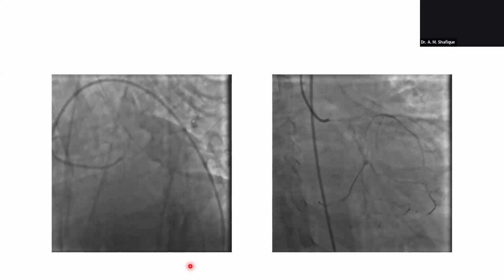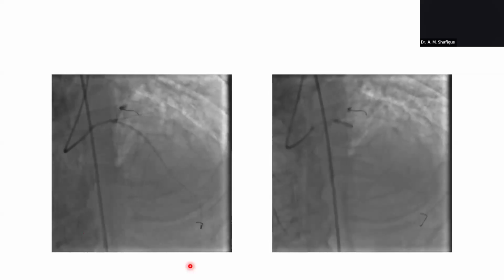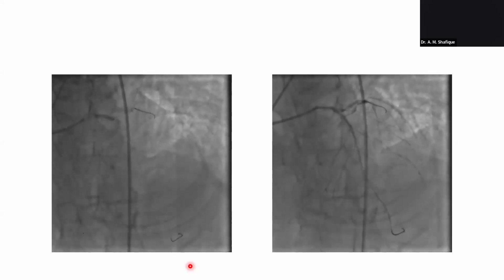So we are doing everything rapidly, as at any moment the patient might go into cardiac arrest again. We don't want to take the time, but we tried thrombosuction because we don't want to dislodge thrombus anywhere, and then we dilated. Everything was for a few seconds only.